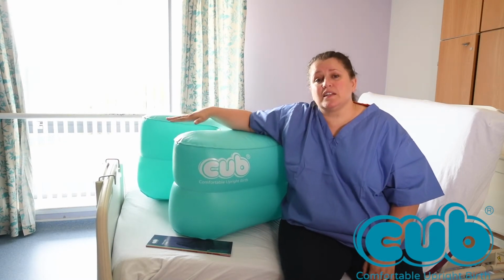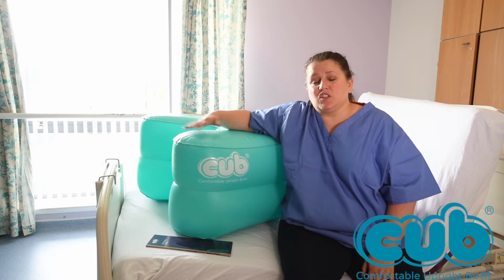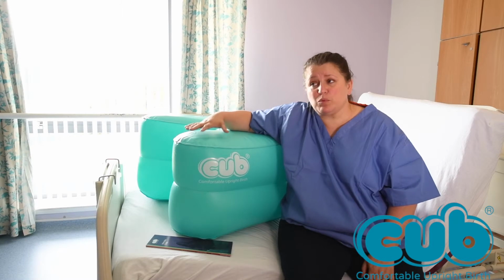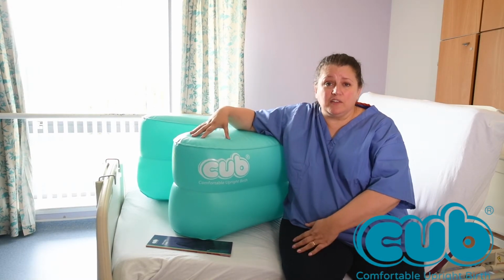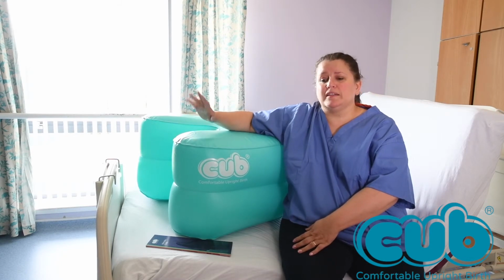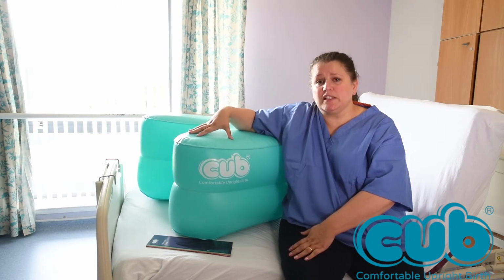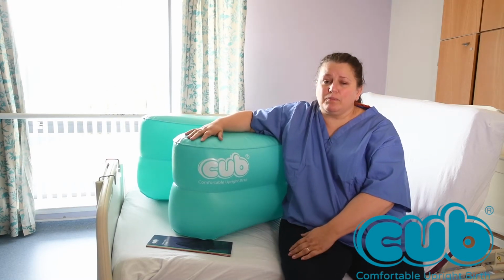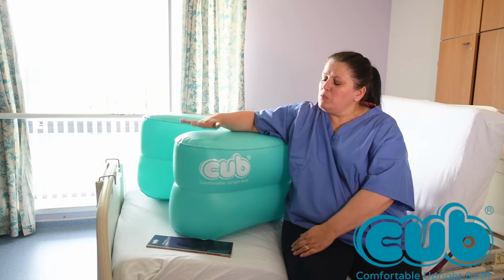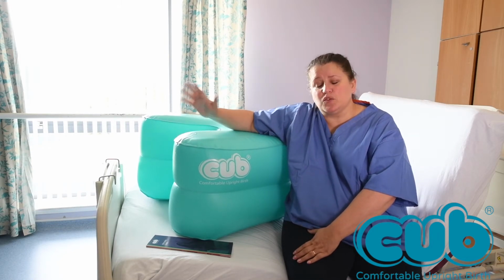However, what we recommend is that it's rinsed initially. Any obvious contamination is rinsed off, and then it's dried with some paper towels, and then you can use sporicidal antibacterial spray or wipes. Whatever you use to clean your delivery beds in your unit is safe to use with the CUB. It can also be cleaned with a 10,000 parts per million bleach solution, and a Milton solution can be made up to that effect as well. So you clean off any surface contamination you can see, dry it with paper towels, obviously wearing your personal protective equipment, gloves, aprons, mask if that's what's required in your unit. Once you've dried it off, you then spray or wipe it with your cleaning solution and allow it to air dry before you deflate it and store it away after that.